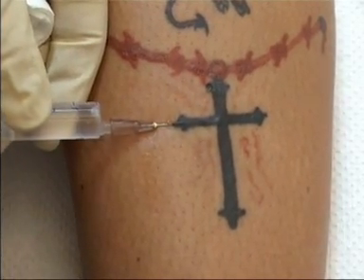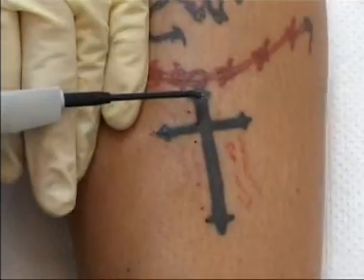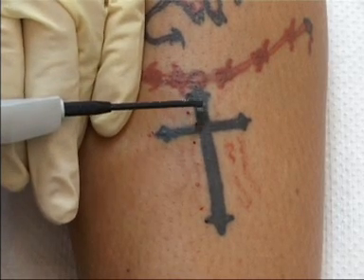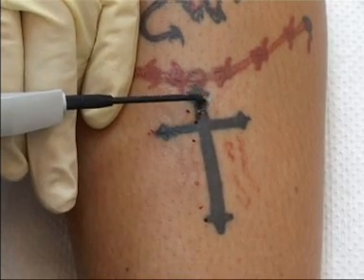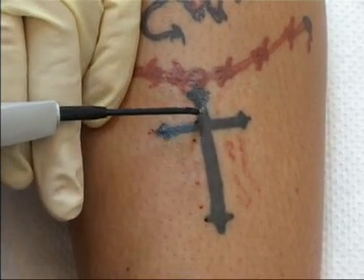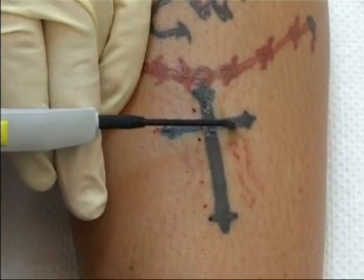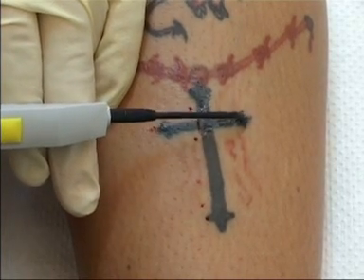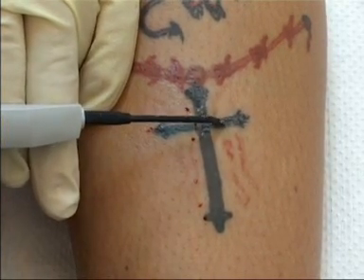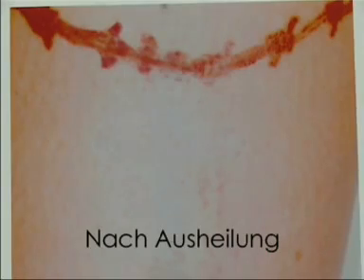Before beginning the treatment, it is recommended to sub-inject the tattoo with a local anesthetic. As already mentioned before, this demo CD does not show all steps of the entire treatments. This new method of removing a tattoo is not dependent on the tattoo color and when performed correctly brings about a scarless, full healing as the basement membrane is not injured. After the healing.